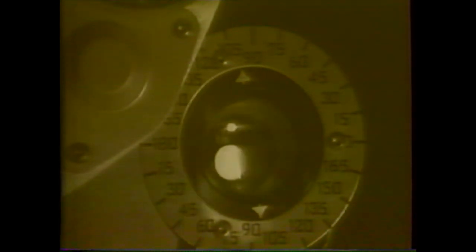Here we see that the with movement is unbalanced between the two principal meridians — we need more plus power to neutralize the streak in the vertical meridian. The vertical meridian is parallel to the cylinder axis, so we need to add more plus cylinder power to decrease the with movement. We check the power cross again — this time it appears balanced, and it stays balanced as we move slowly outward to the normal working distance.